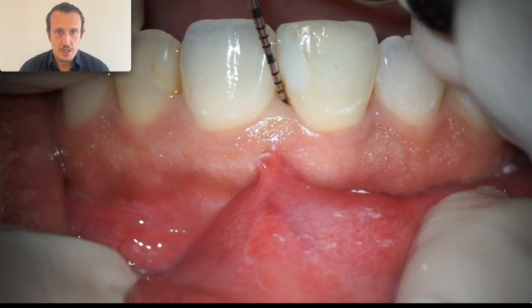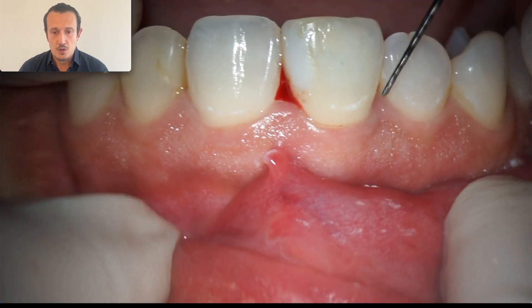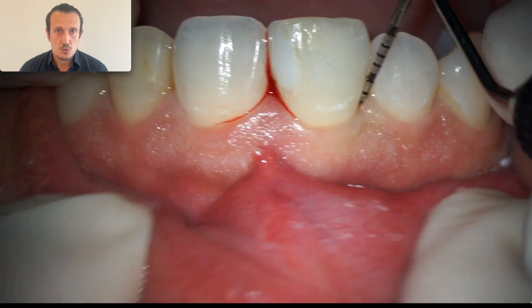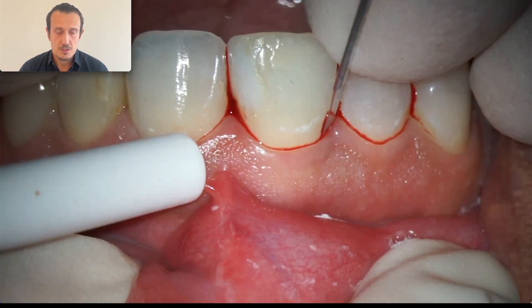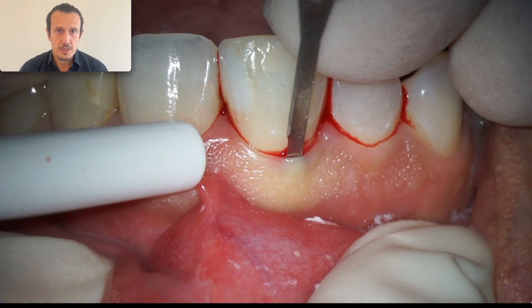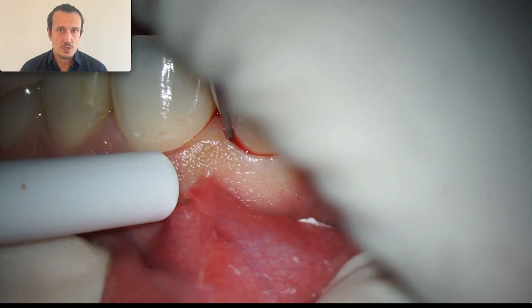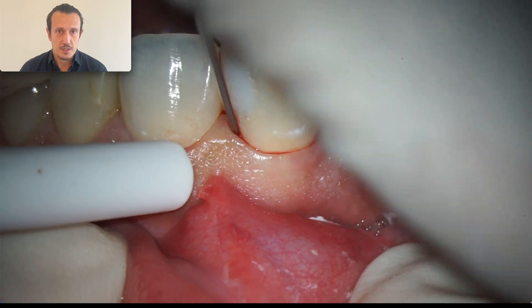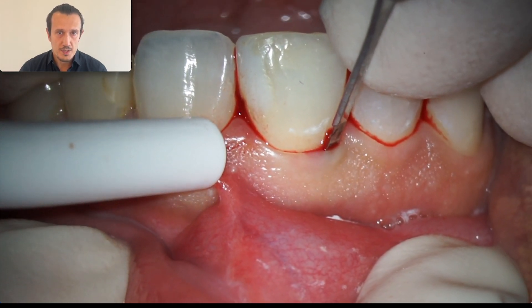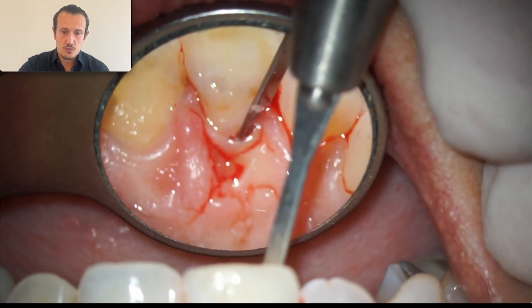The main thing when doing immediate implant placement, for me, is to keep the papilla intact. I pay a lot of attention to keeping the papilla attached to the neighboring teeth and not to damage the papilla in any way. First I'm going to use a small blade — a Hu-Friedy blade — just detaching the soft tissue from the tooth, the supra-crestal ligaments.